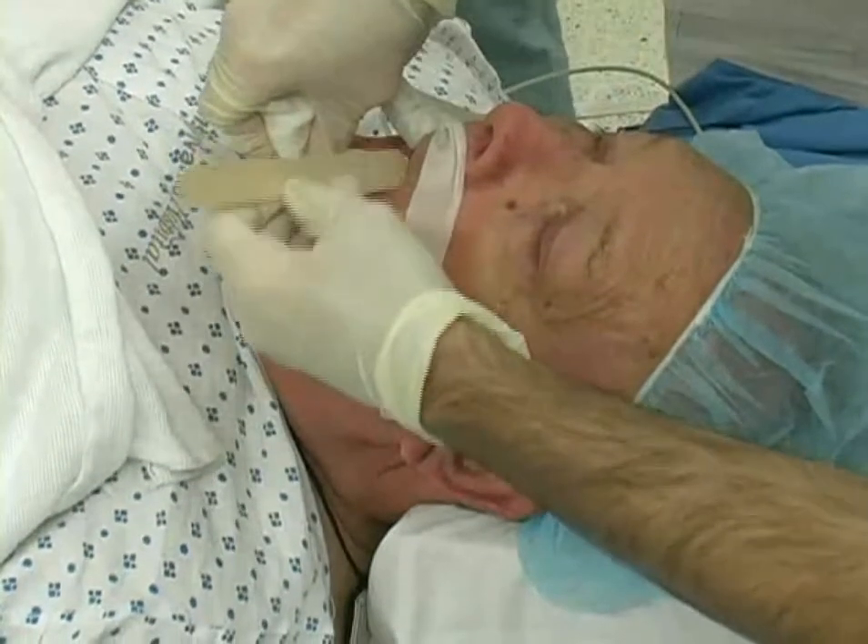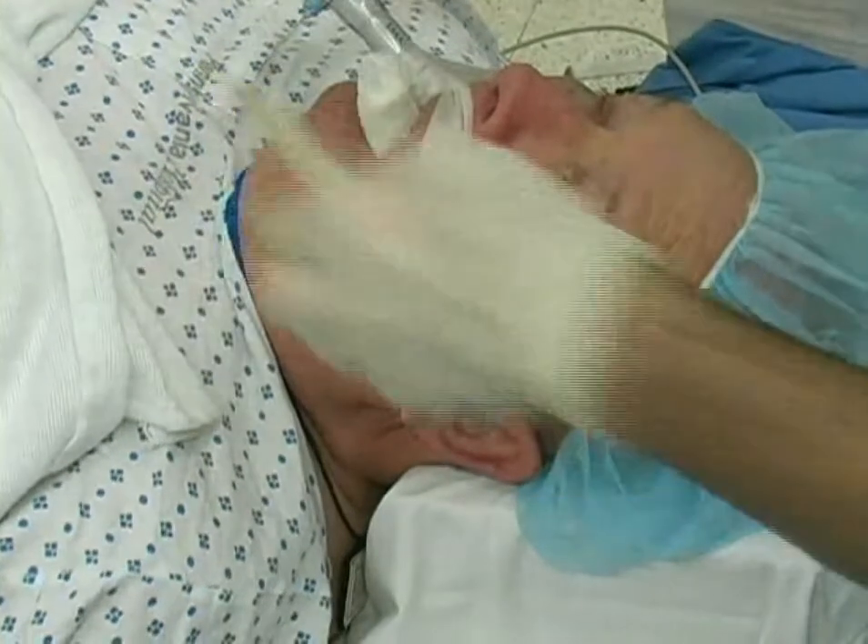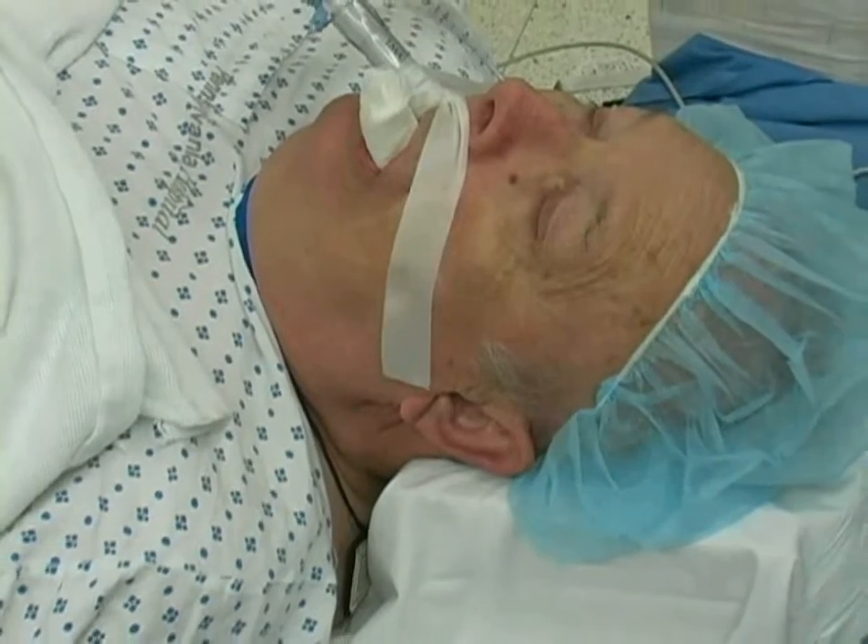A soft bite block is made with 4x4 cotton gauze and inserted into the mouth alongside the LMA between the molar teeth.